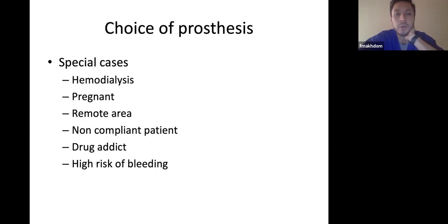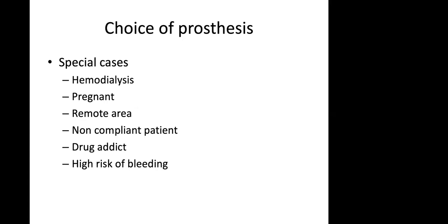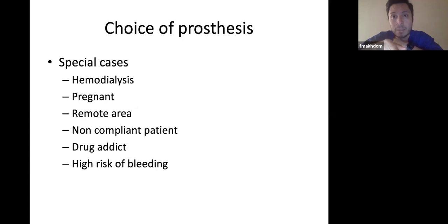But we all should be aware that the rate of degeneration for biological valves in those patients is very high. But anyhow, most of those patients now are very high risk hemodialysis patients. Those who will have a transplant, and those who will not have a transplant usually have TAVI.